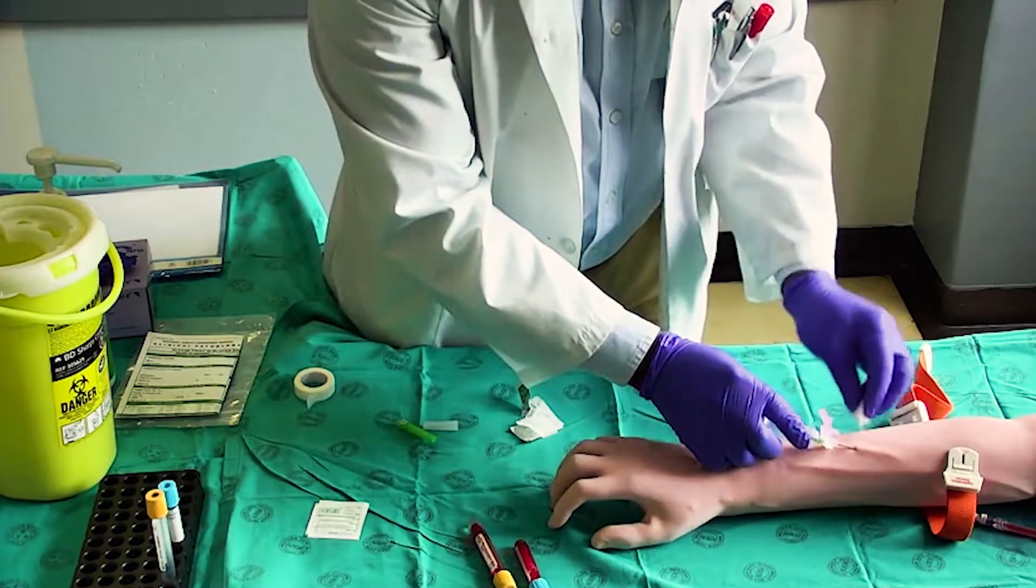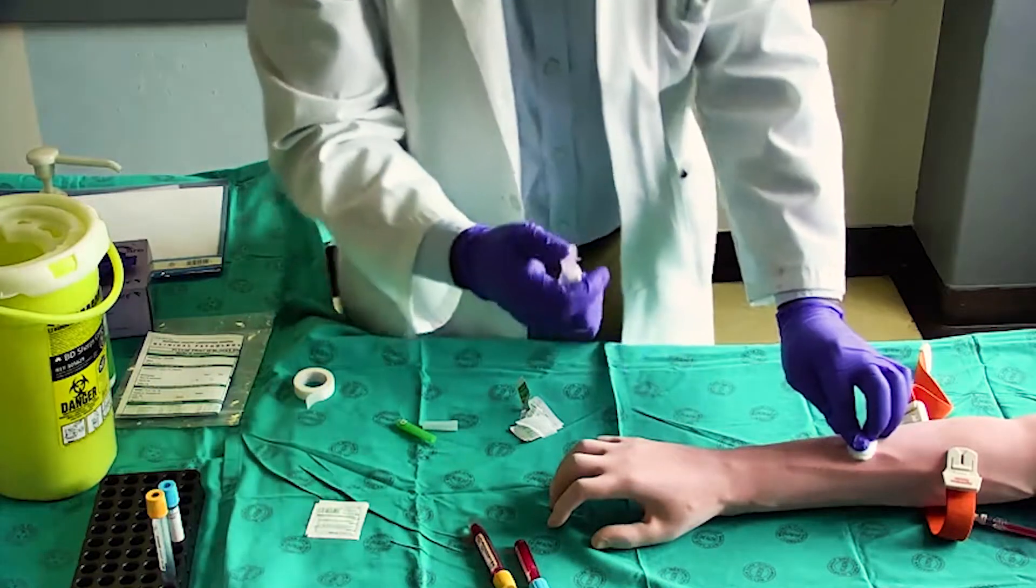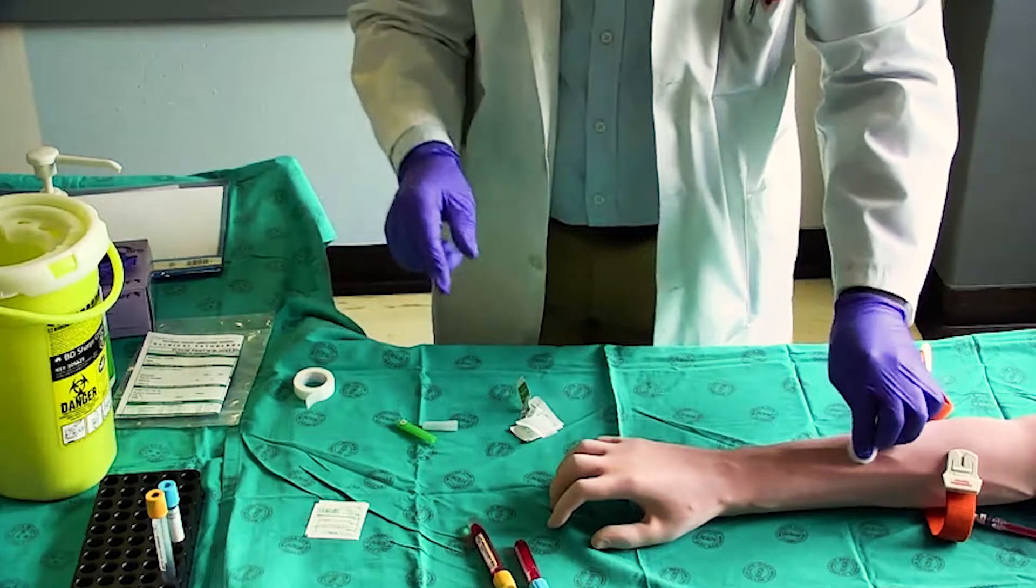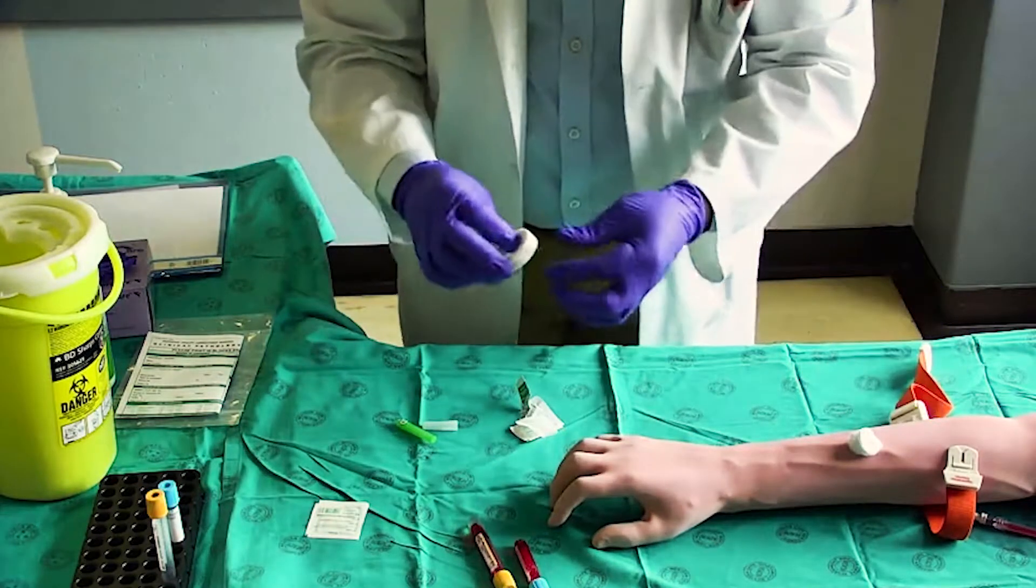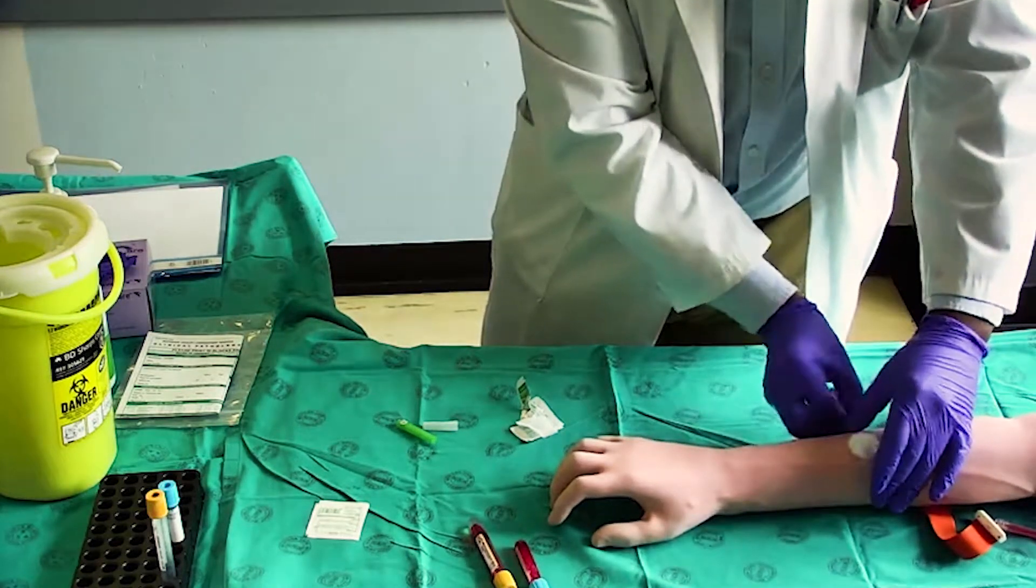Withdraw the needle gently and apply gentle pressure to the site with a dry, clean cotton wool ball. Discard the vacutainer needle together with the vacutainer barrel into the sharps container. Secure the cotton wool with tape.